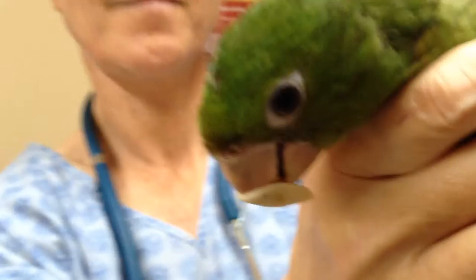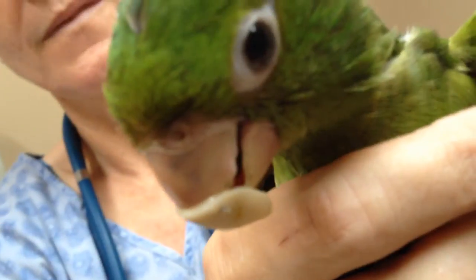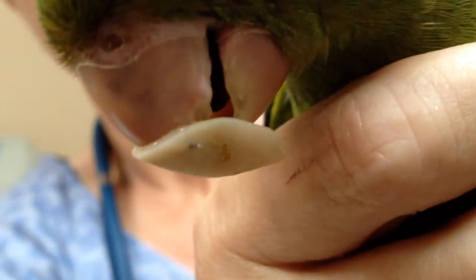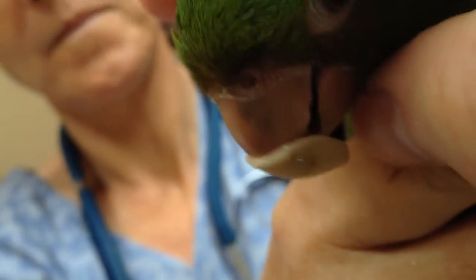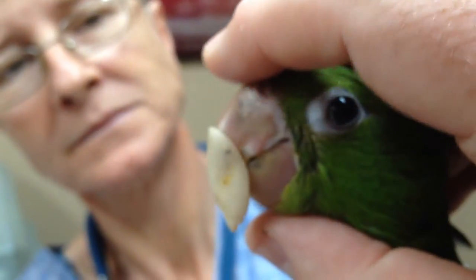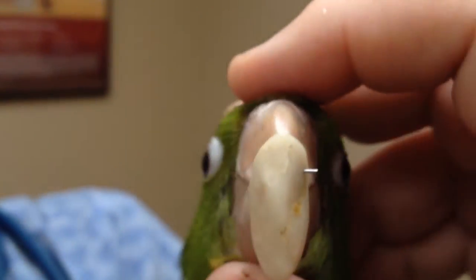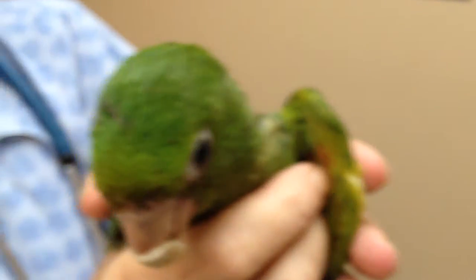All right, there's our little white-eyed conure. It's been a little bit over a week. We're trying to take care of his prognathism - that means his lower beak is longer than the upper beak. We actually built this little prosthetic device to make sure that his lower beak only has one place it can go. I just did a little bit of trimming, and if you watch here, that looks like a perfect bird beak right there. We're checking again next week and we may actually remove the device next week. You may get that lucky.